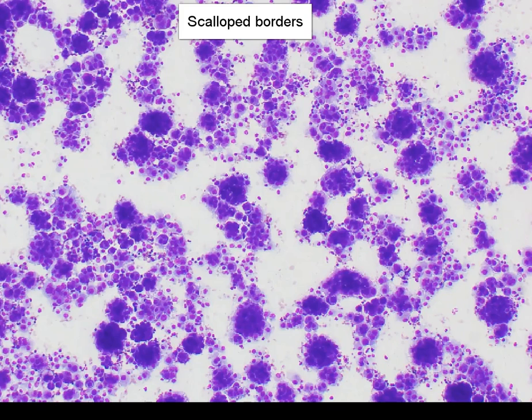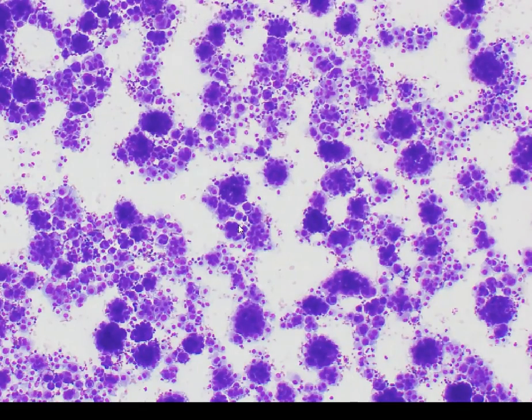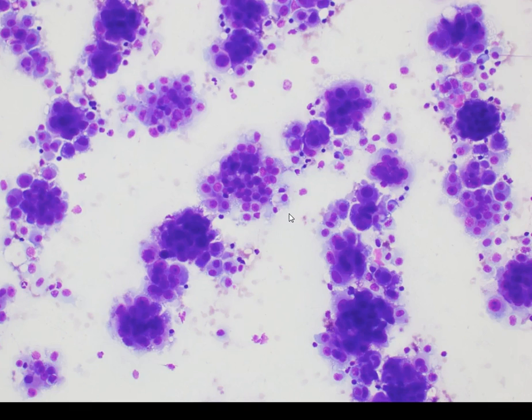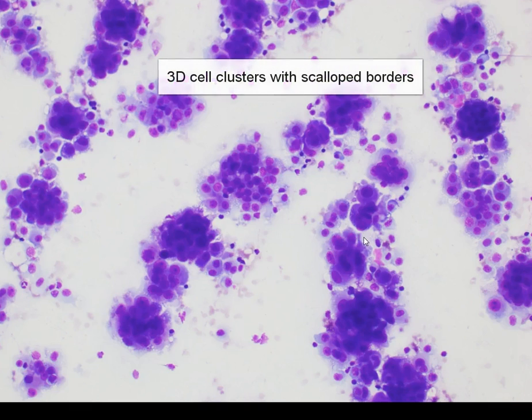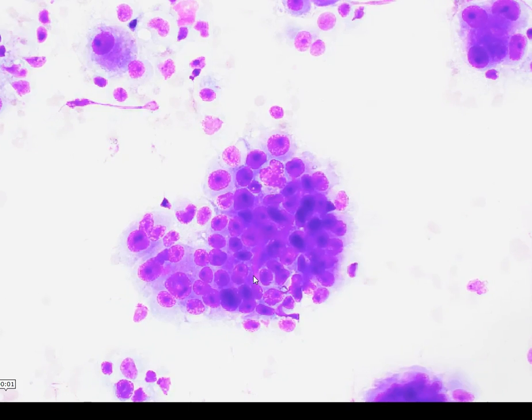At a slightly higher power, we can see that the clusters are relatively small. They're quite dense and three-dimensional, and we do not at this power appreciate marked nuclear pleomorphism. Here we can appreciate the scalloping of the outlines of these cell clusters. We are not seeing smooth and very rounded community borders like we would see in the classical adeno-CA.